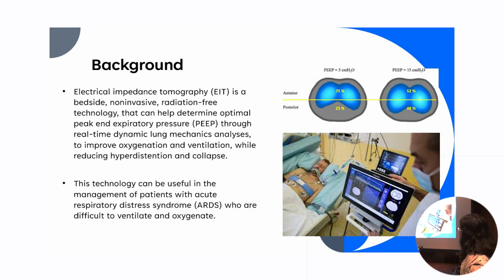We usually park it next to our ventilator, and you can see in this picture the band that goes across the chest. It's actually 2 separate bands, and each band has 16 electrodes, so 32 electrodes total go across the chest. Placement is usually above the nipple line, underneath the armpit, in that 4th to 5th intercostal space.